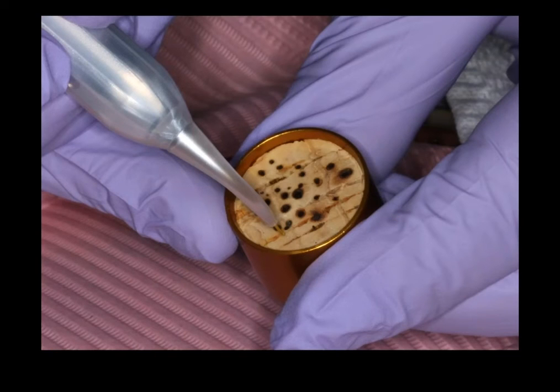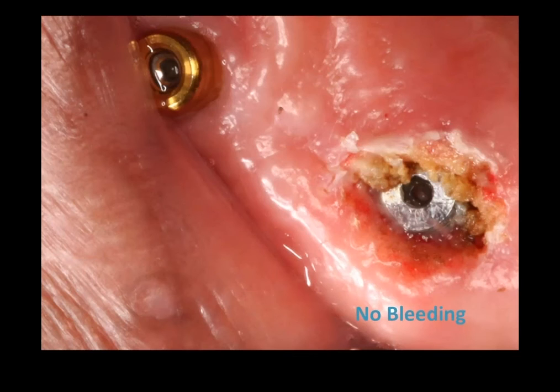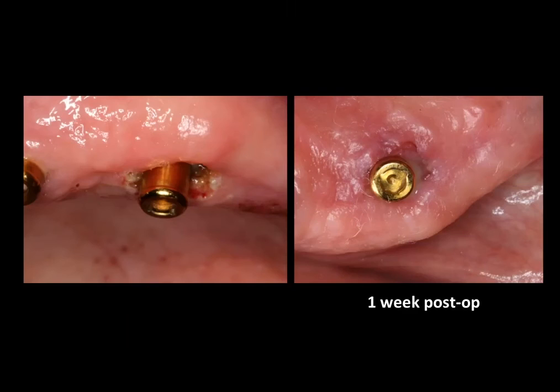As I showed you before, we'll initiate the tip. That white there is not purulence, it's the membrane that we had placed. Without anesthetic, we can uncover the implant and simply replace that locator abutment into that site. And 1 week post-op, we get very, very nice healing around the implant. And we were able to maintain and salvage it quite effectively.